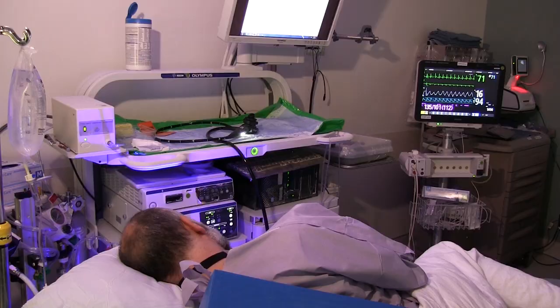The Bravo pH monitoring system is a catheter-free way to measure the amount of acid your esophagus is exposed to over a period of time.